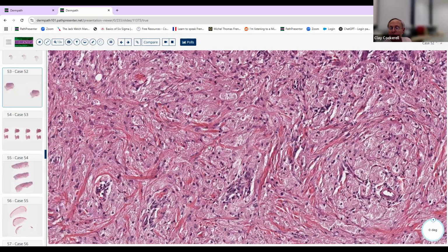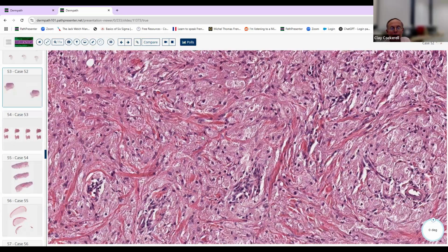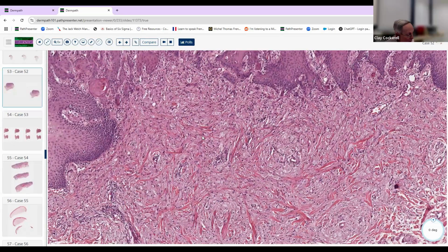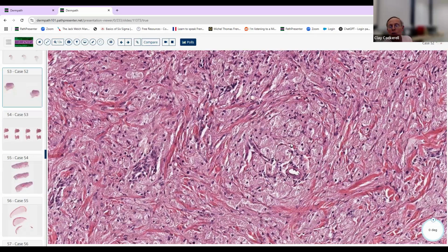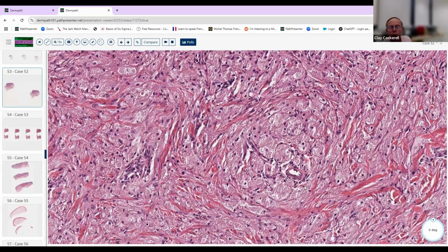These cells are in the family of neural differentiation. These cells are trying to make myelin. They fail, and they form lysosomes of Schwann cell myelin breakdown products, positive with S100 protein and PAS. So your choices here, it's certainly not xanthoma. Now you might say, malakoplakia, what does that look like? When we see that, we get these Michaelis-Gutmann bodies, these very eosinophilic pink structures associated with a lot of granulomatous inflammation. Doesn't look anything like this.